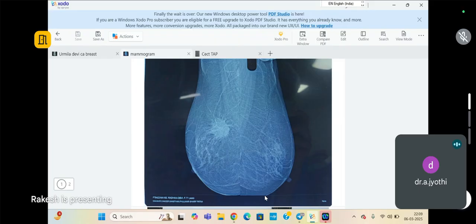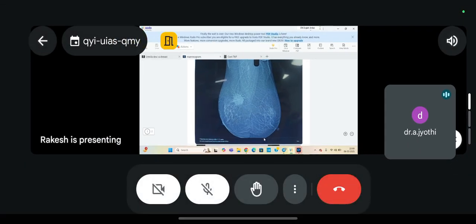So, tell me something about MRI. What are those curves called? And which curve is malignant? And why is it so? Kinetic curves. What is the phase name? Phase 1, phase 2, phase 3: plateau. They are called Kuhl's curves. Then what are type 1, type 2, type 3? Type 1 benign, type 3 malignant, type 2 indeterminate.